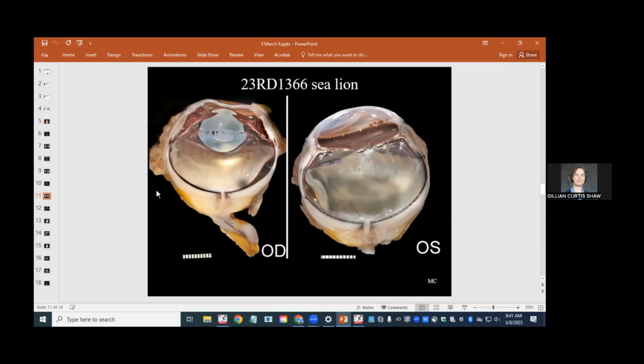In the right eye, the only thing I'll point out on the gross is this very subtle thing right here. In the episclera, we have these two little off-whitish bumps, and they're very crisply demarcated. In cross-section, they look like elongate, oval-shaped structures, tight against the eye in the episcleral connective tissue.